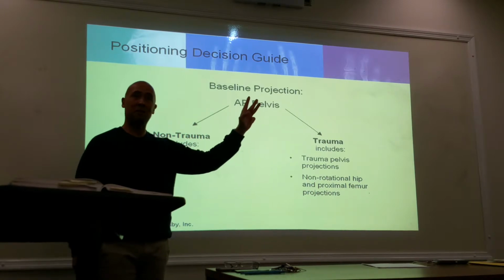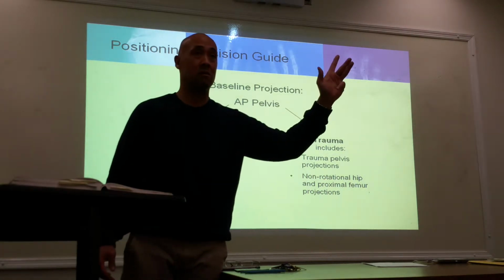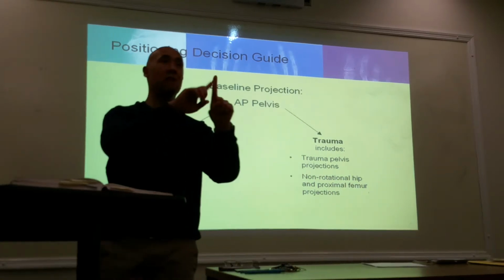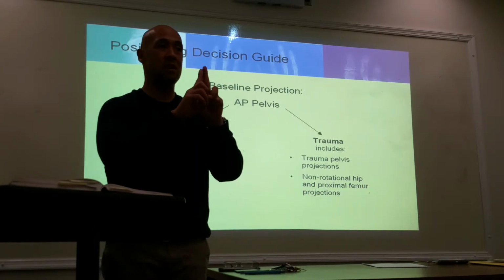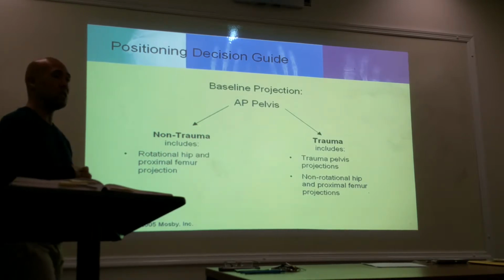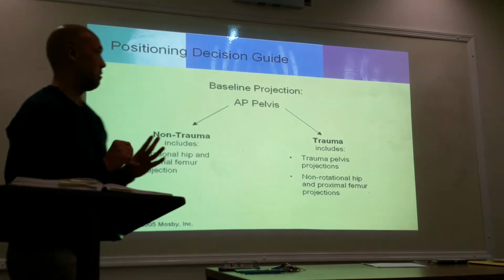You guys remember what I meant about the radiographic hip? So the radiographic hip is we're trying to take a picture of the hip joint. Everybody got that? Routine views for the hip is 1 pelvis, an AP hip, and a lateral hip. Those are your routine views. AP pelvis, AP hip, lateral hip.